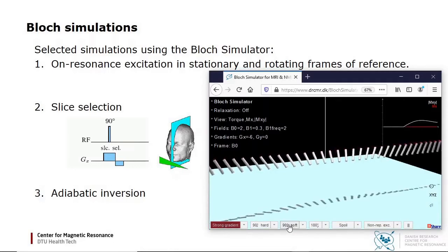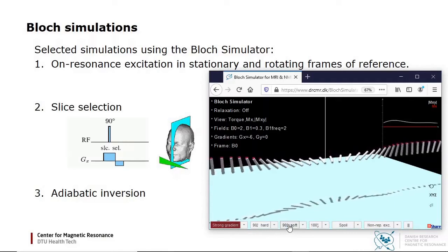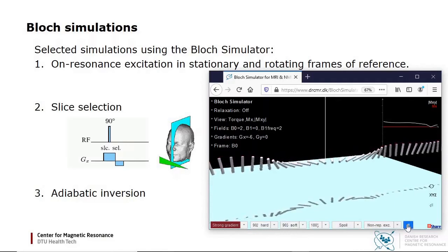I pause the simulation here after excitation to examine the result. Since the field varied between positions during excitation, the effective field vector is pointed in different directions for different nuclei, and only on resonance was it transversal. That was in the middle, and those nuclei are therefore excited 90 degrees.